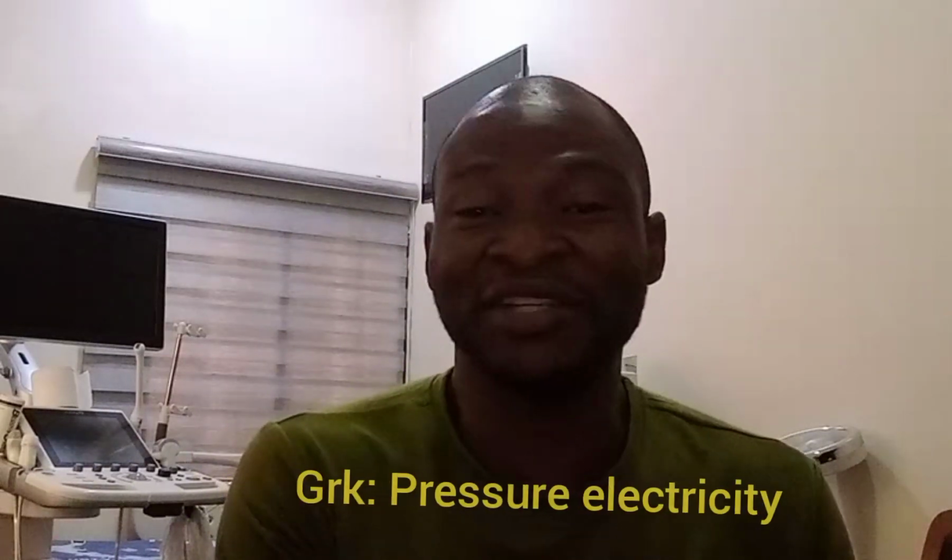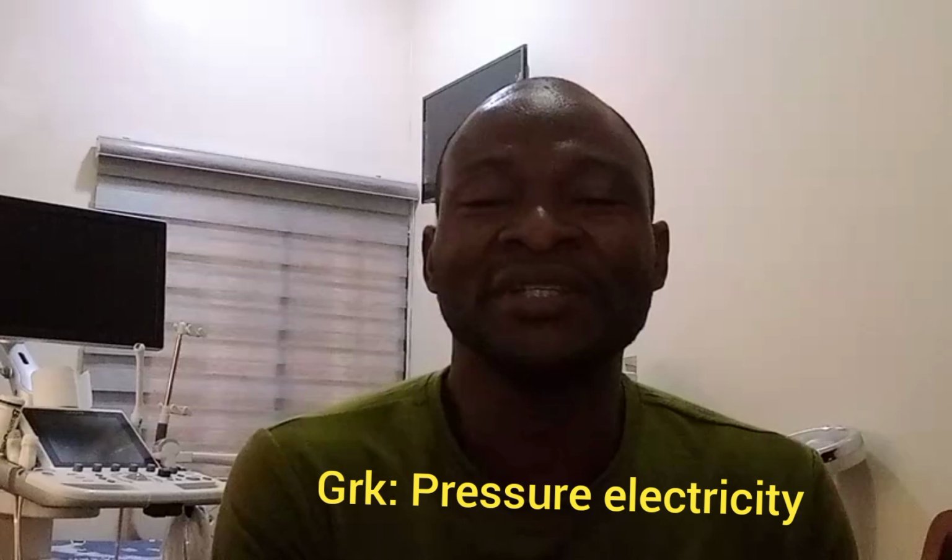So piezoelectric effect, let's see how this works. This is a property of a certain material or element to create vibrations when voltage is applied to them, or when they are mechanically deformed. Now, piezoelectric in the Greek word means pressure electricity.